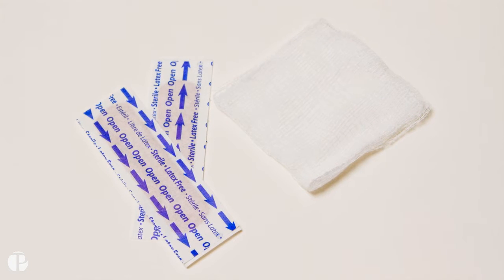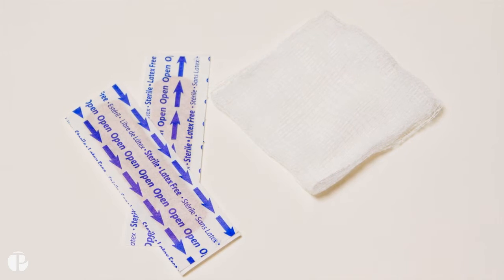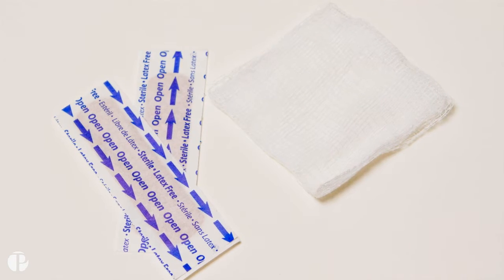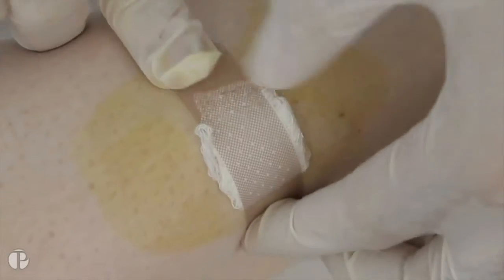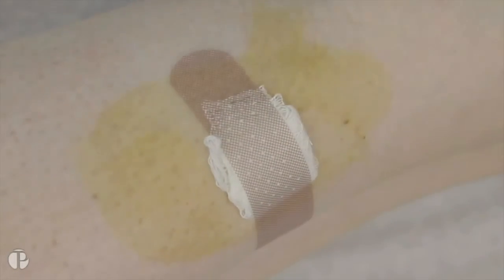Therapath provides two adhesive bandages and gauze. After the procedure, cover the biopsy site with the supplied gauze and bandage. The patient should leave the biopsy sites covered for 24 hours with your original dressing.